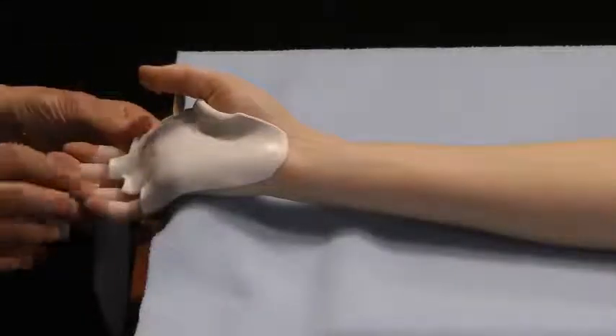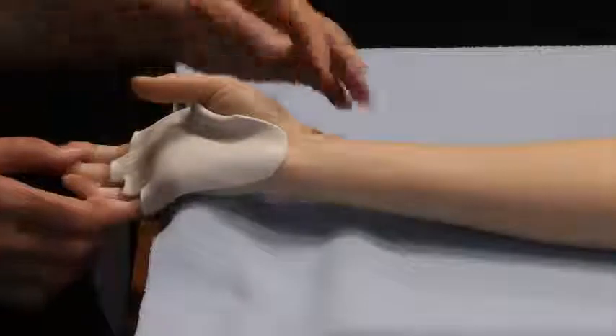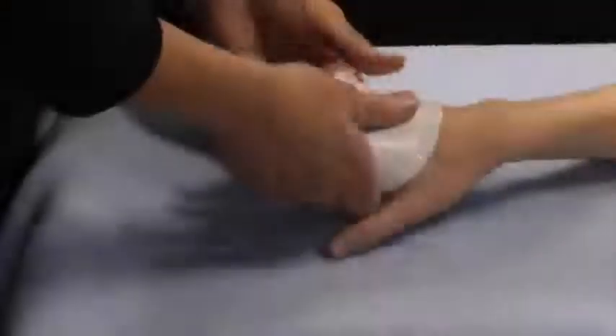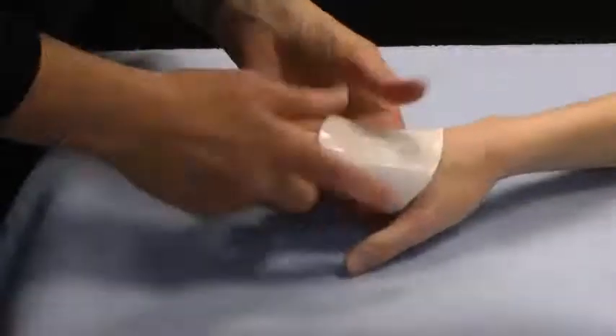It's just the edge — I don't want to push the finger forward. Pull this just enough that I have a little overlap on the radial aspect, which I'll show you in a moment.